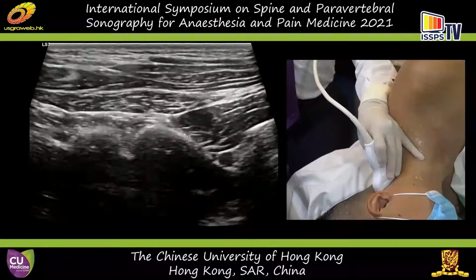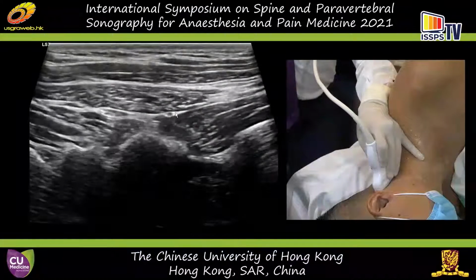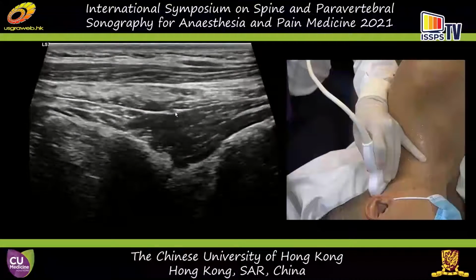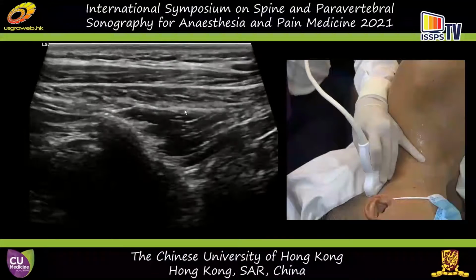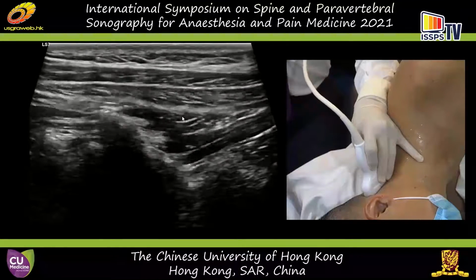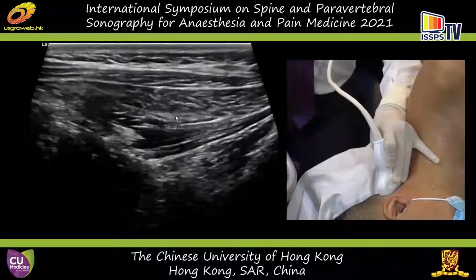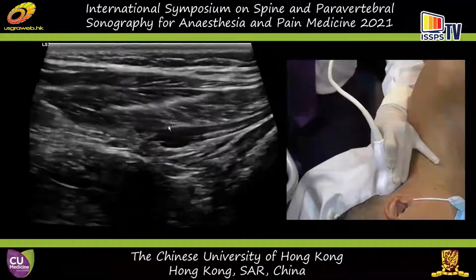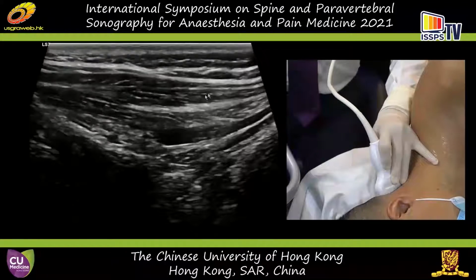And you can see it comes out and it gives this greater occipital nerve right here. And this greater occipital nerve here, if I keep going medial, is going to wrap around this inferior oblique, and it's going to go midline, and it's going to pierce through this semispinalis capitis, and then also the upper trapezius.